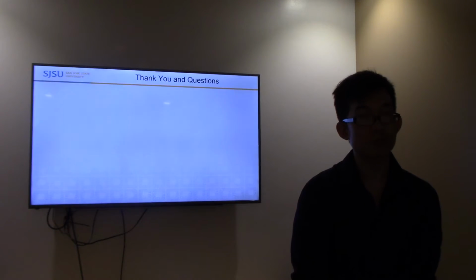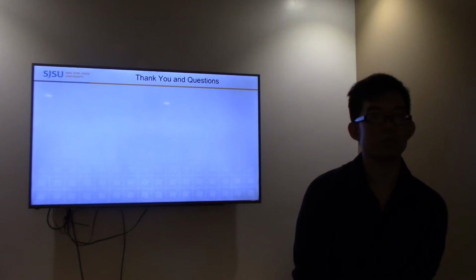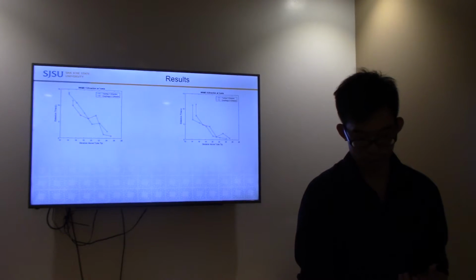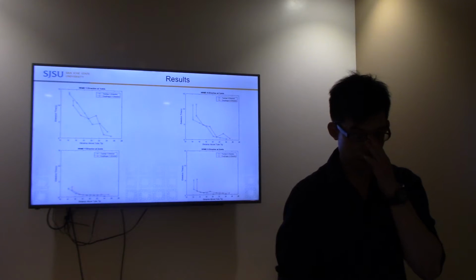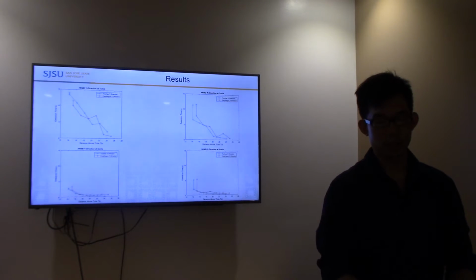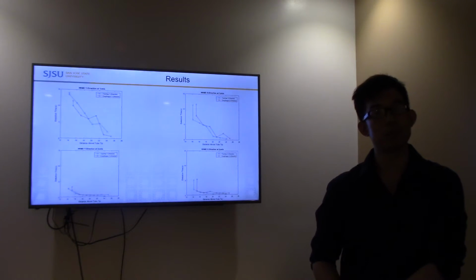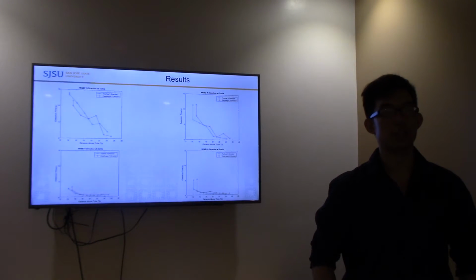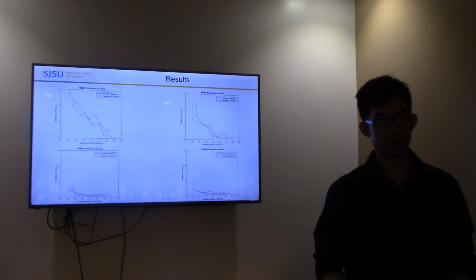You were reporting for a while, you said detection time? Right, so for the handheld metal detector, I record the time when it first detects the metal, when it starts making noise and vibrating, and then the end time when it stops. Okay, and that was what was on the conveyor? Yeah. So the idea is that as it's passing through, when it first hits it, it's going to detect it, and as it passes through, then it's just a go.